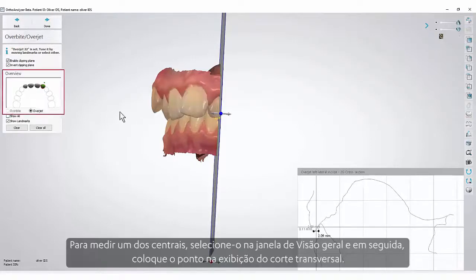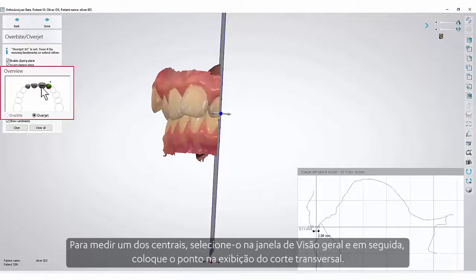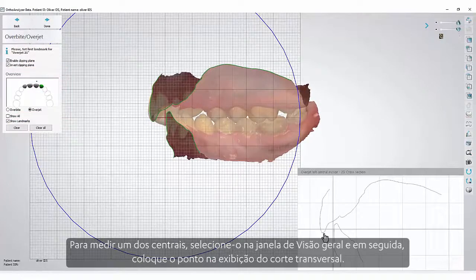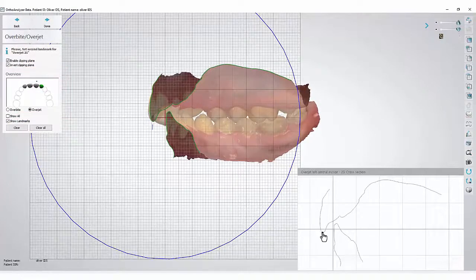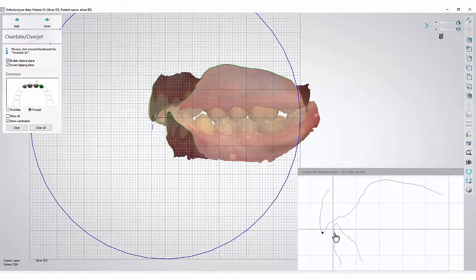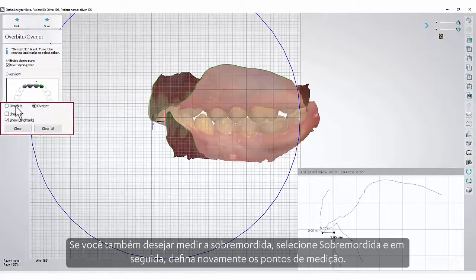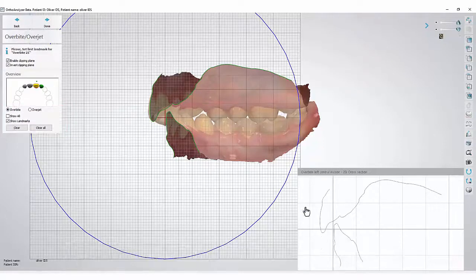To measure one of the centrals, select it in the Overview window and then put the point in the cross-section view. If you wish to measure the overbite as well, select Overbite and then set the measurement point again.